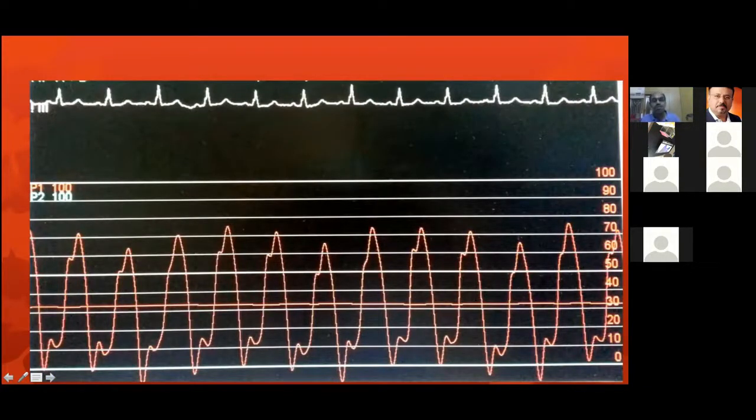Now in ventricular pressure, this is the standard triangular trace of a right ventricle. We were talking about how to identify what is optimally damped. A right ventricle should have a pressure trace like this. It should be triangular in configuration.